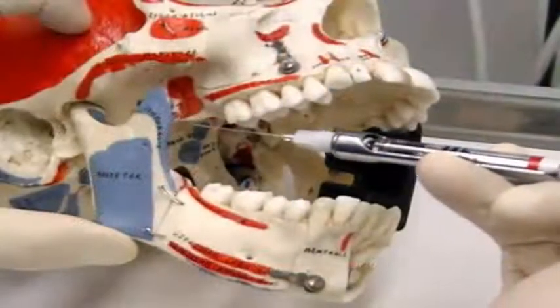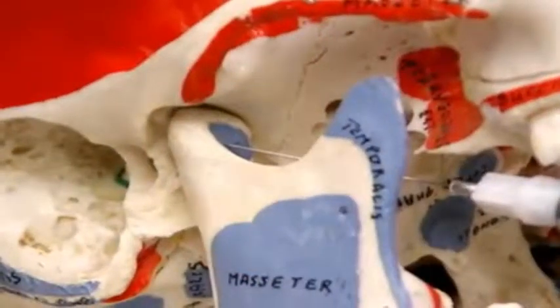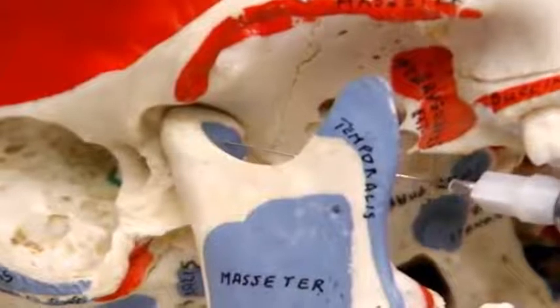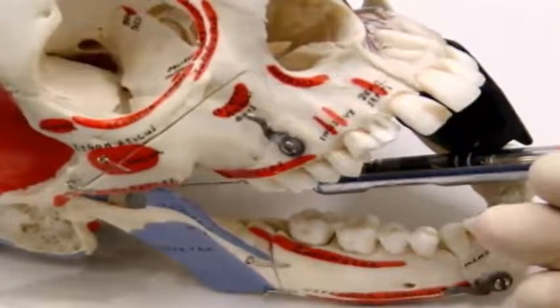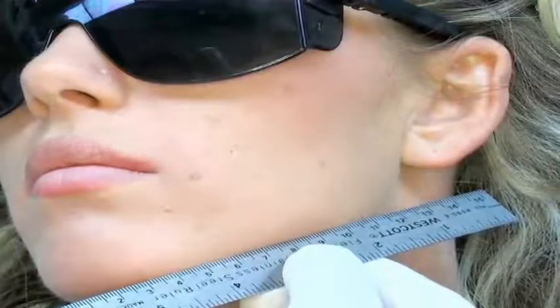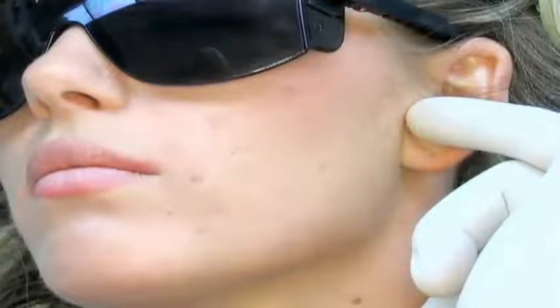On the skull, note the superior position of the needle and the barrel of the syringe. The target zone is the anterior head of the condyle, which is a small target. Note the orientation of the barrel of the syringe, which is parallel to the inferior border of the mandible. On a patient, there are two landmarks: the inferior border of the mandible and the intertragic notch on the outer ear, which will be the target for the tip of the needle.